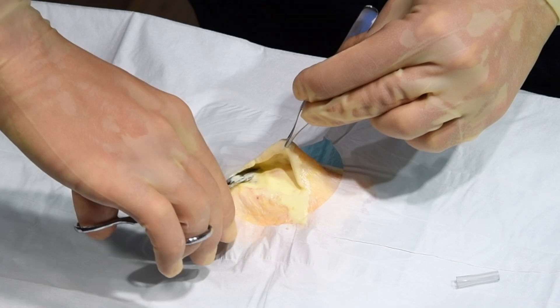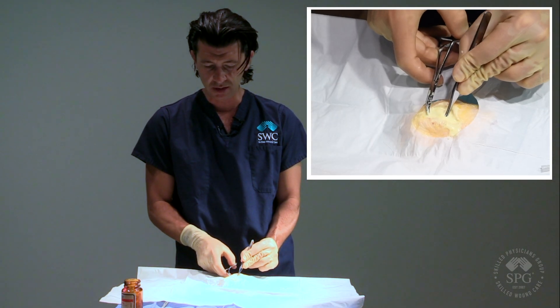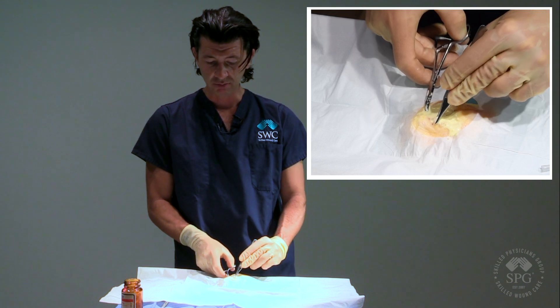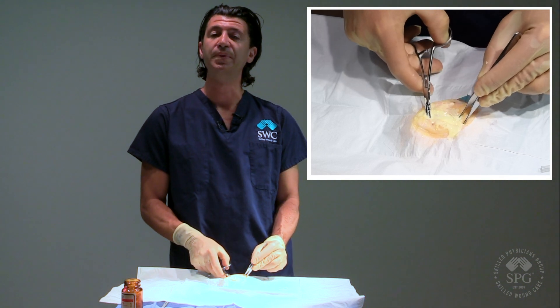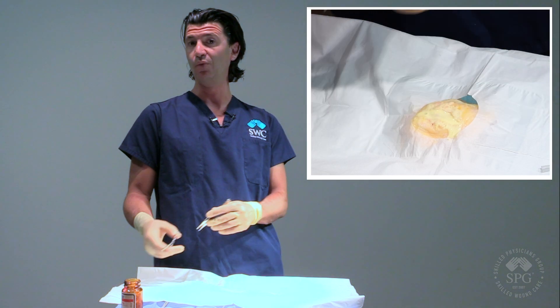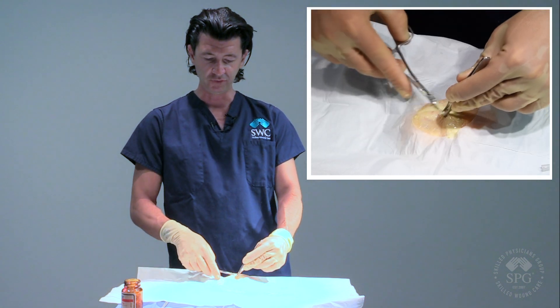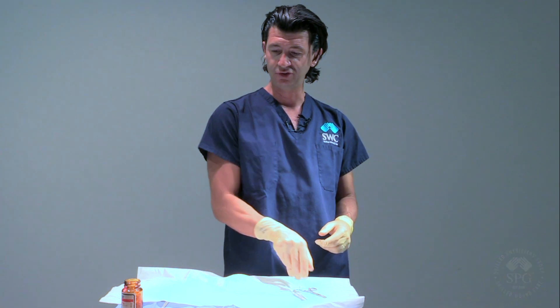This is probably a larger incision than you should make — I would probably not go more than maybe three to five centimeters, or about an inch to an inch and a half. You want the incision to remain open to allow for further drainage so that the abscess does not reform. You don't want to just do this and walk away. And you can see that now all of the fluid is coming out — and there is your incision and drainage.